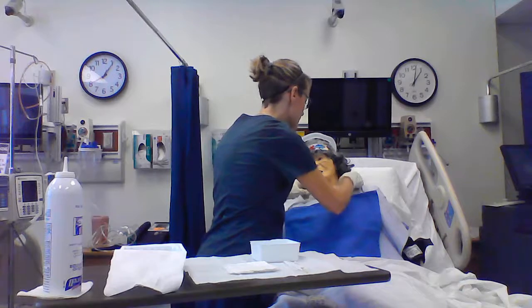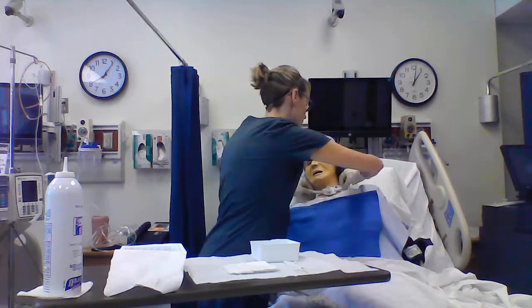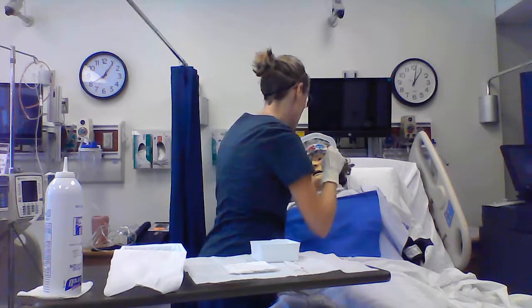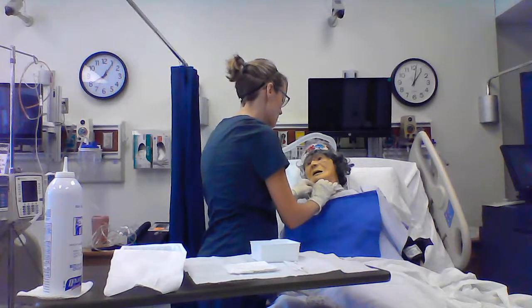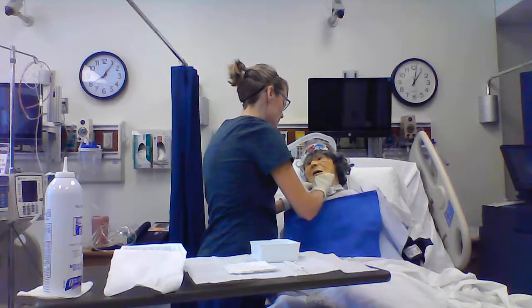So tie off some new ties for her. I want to make sure that I can fit a finger to 2 fingers in there so they're not cutting off her circulation or strangling her with her ties. And then you can remove these old ties after you secure the new.